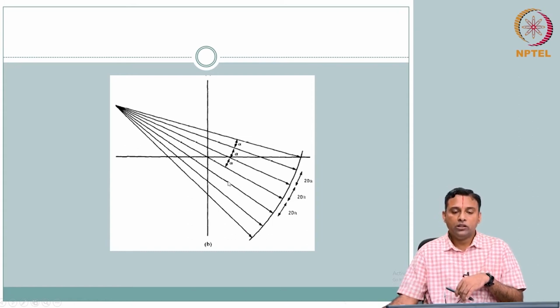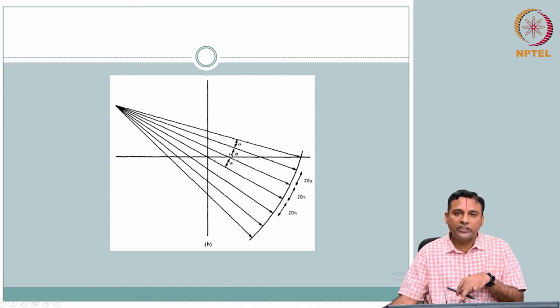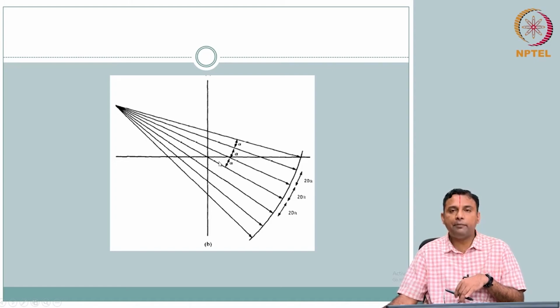The reason you can expect a change is this: we started our reconstruction pretending this is the detector and it is summing everything along these lines, and then we back project and the geometry was parallel. Whereas here you have to back project along lines which can be described more in angle or length, depending on how you define the system, okay? So we will take this configuration.